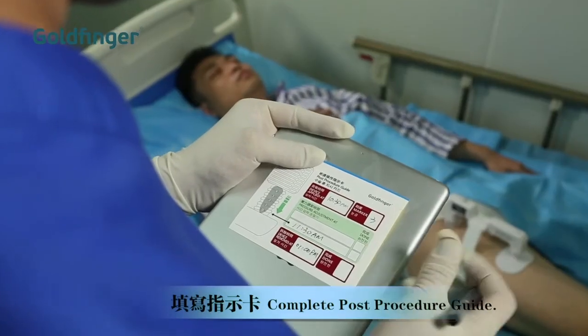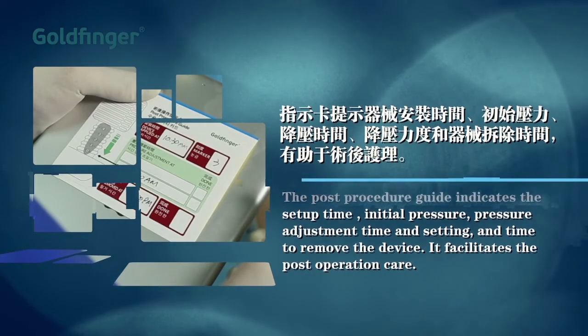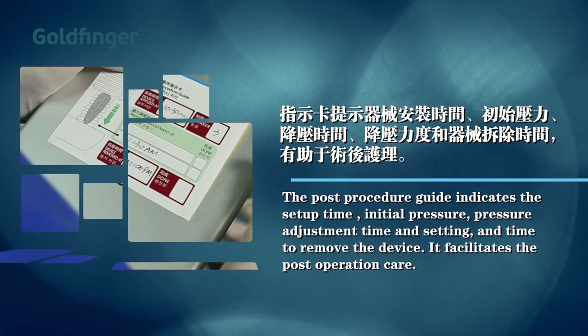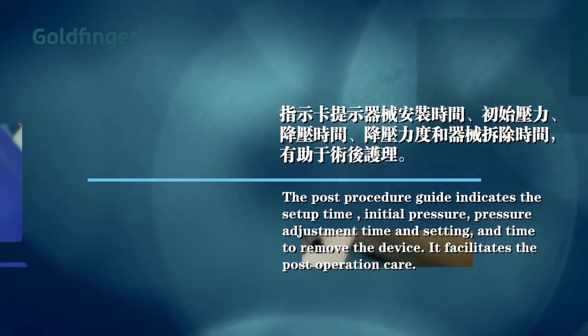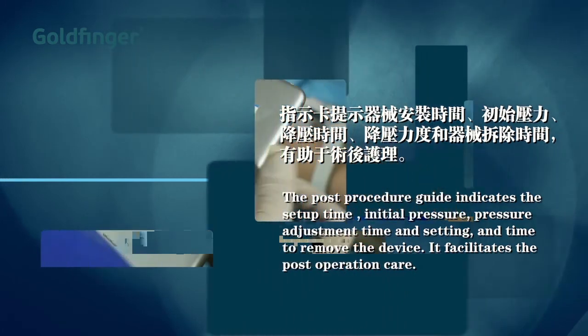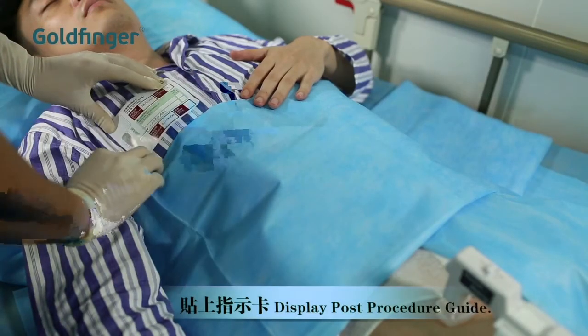Lock the safety at the right pressure. Complete the post procedure guide, which indicates the setup time, initial pressure, pressure adjustment time and setting, and time to remove the device. It facilitates post-operation care. Display the post procedure guide near or on the patient.